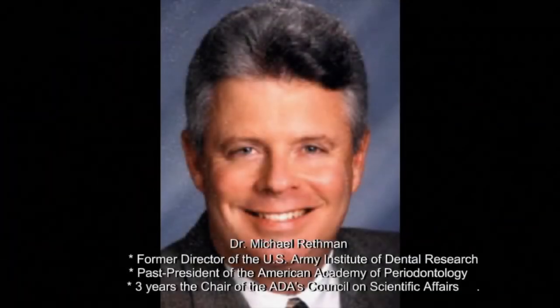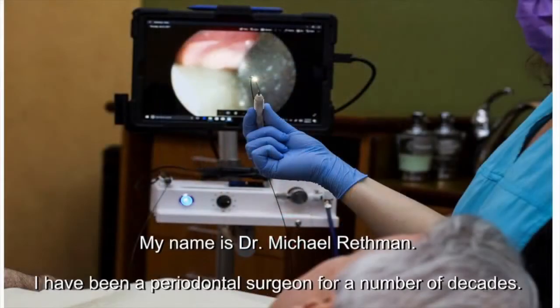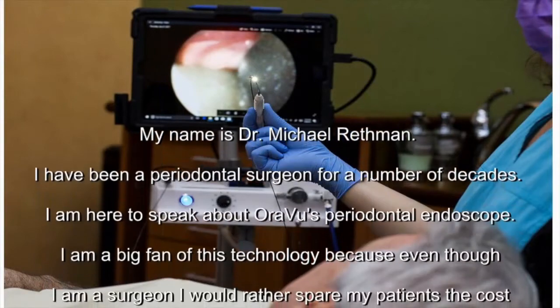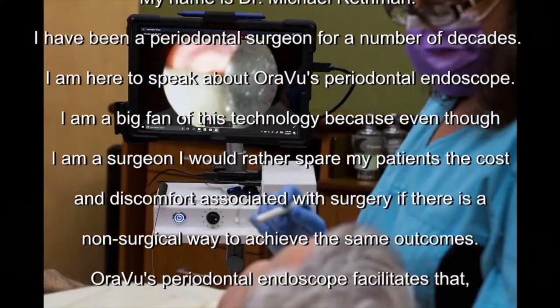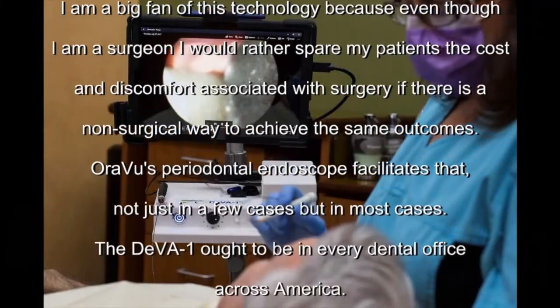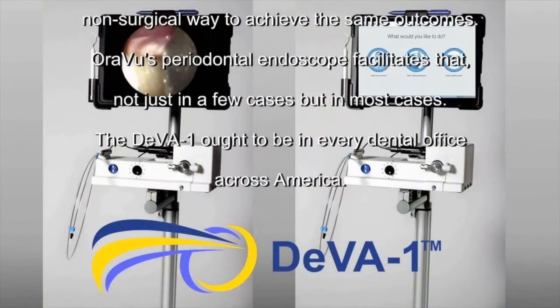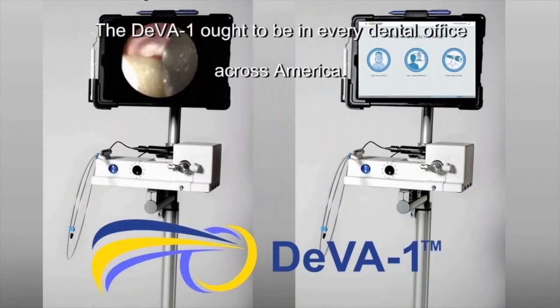My name is Dr. Michael Rethman. I've been a periodontal surgeon for a number of decades. I'm here to speak about OraVu's periodontal endoscope. I'm a big fan of this technology because even though I'm a surgeon, I'd rather spare my patients the cost and discomfort associated with surgery if there's a non-surgical way to achieve the same outcomes. And OraVu's periodontal endoscope facilitates that, not just in a few cases, but in most cases. It ought to be in every dental office across America.